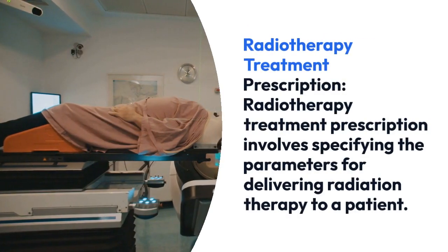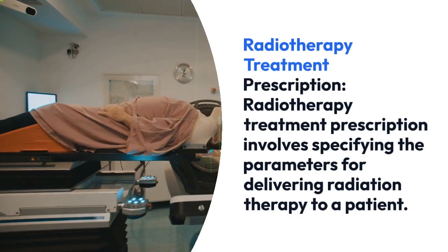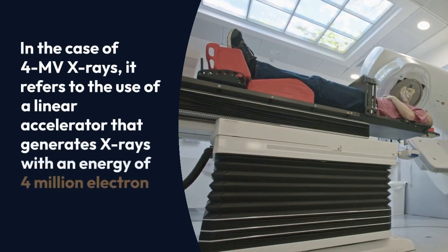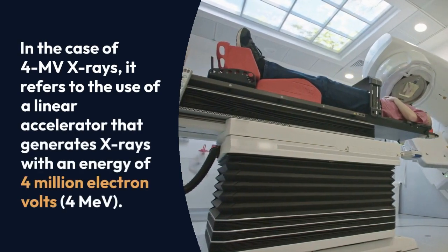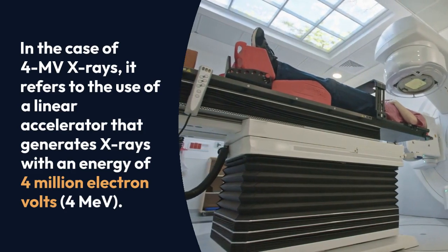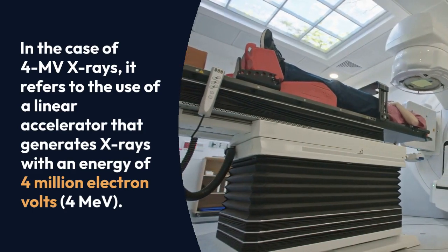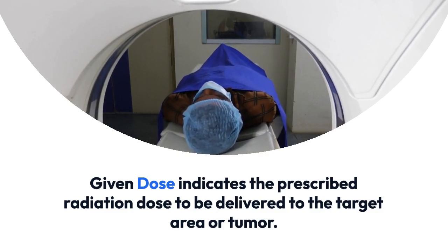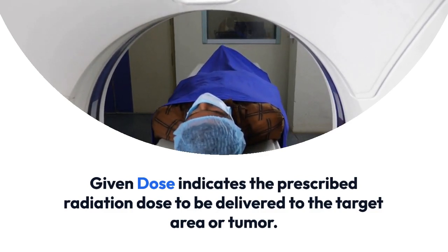Radiotherapy treatment prescription involves specifying the parameters for delivering radiation therapy to a patient. In the case of 4 megavolt X-rays, it refers to the use of a linear accelerator that generates X-rays with an energy of 4 million electron volts. Given dose indicates the prescribed radiation dose to be delivered to the target area or tumor.